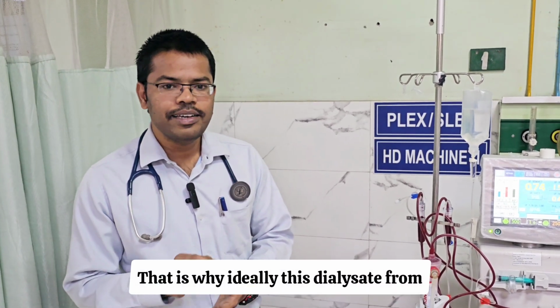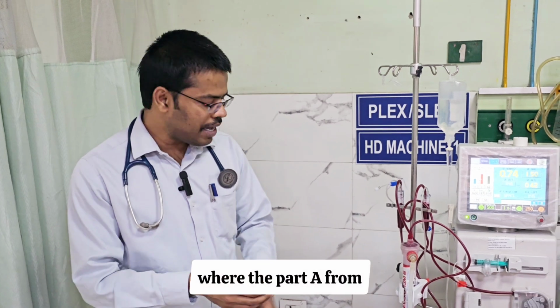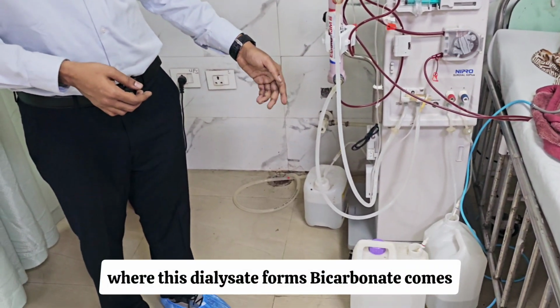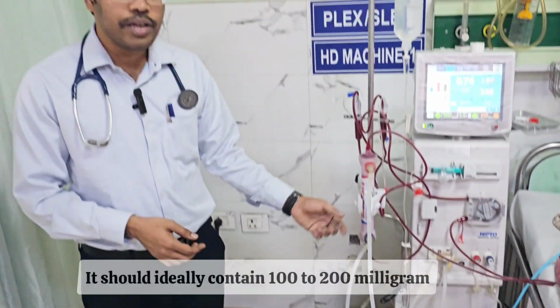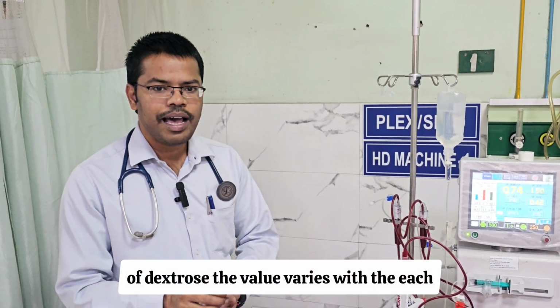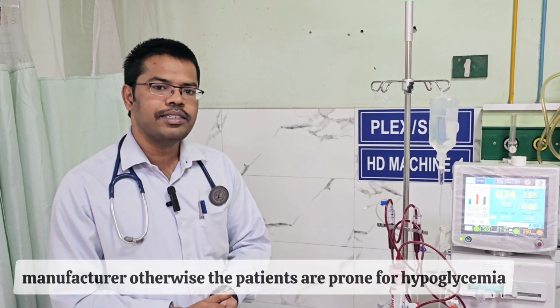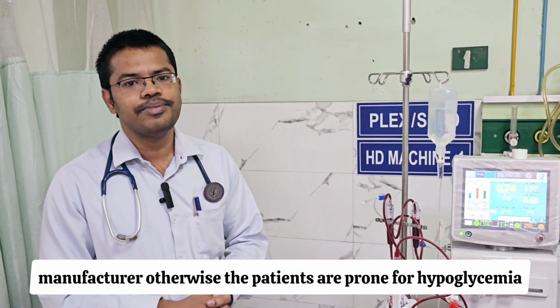That is why ideally this dialysate, formed from part A, with bicarbonate coming from B, and water getting mixed, should ideally contain 100 to 200 milligram of dextrose. The value varies with each manufacturer. Otherwise, the patients are prone to hypoglycemia.